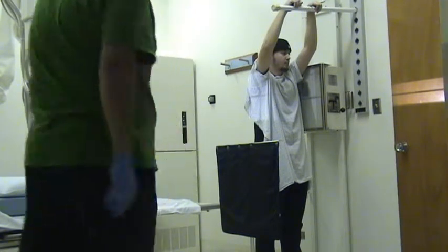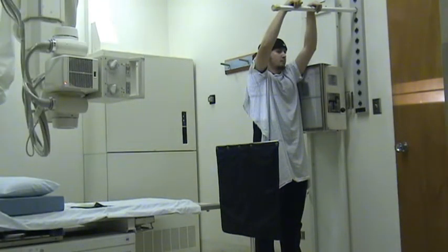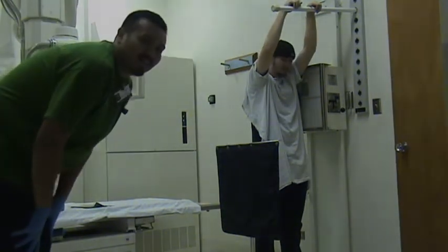So sir, go ahead and take in a deep breath for me, please. You can move out of the way here. Deep breath and hold it. Don't move. Go ahead and breathe and relax. And that's going to be our lateral chest x-ray.